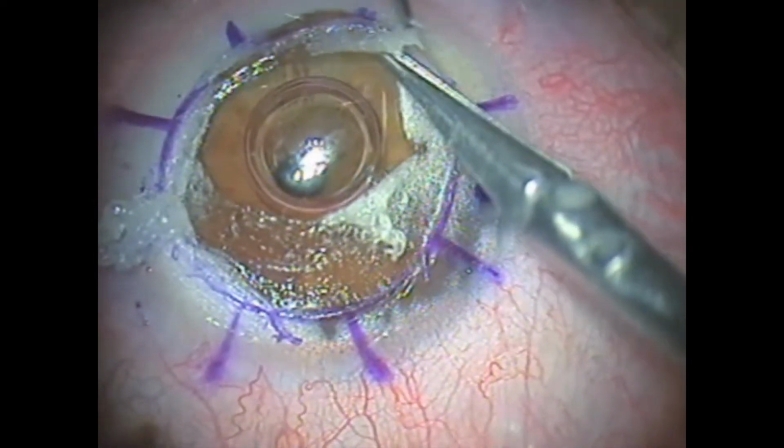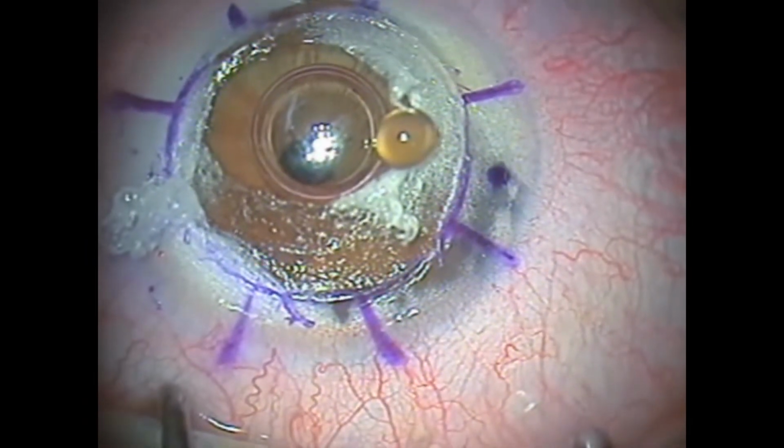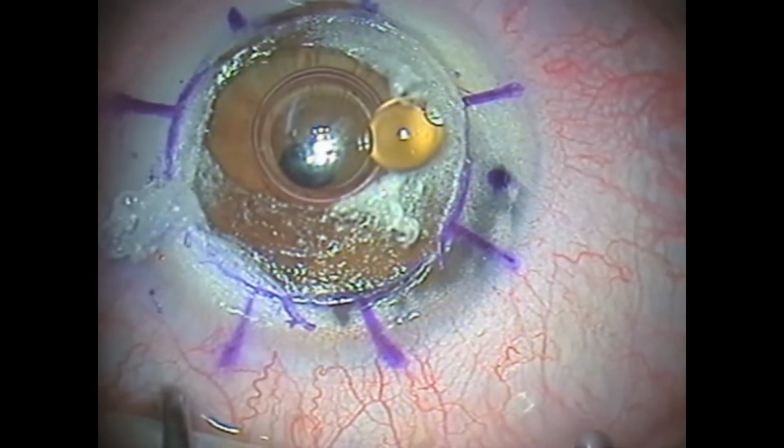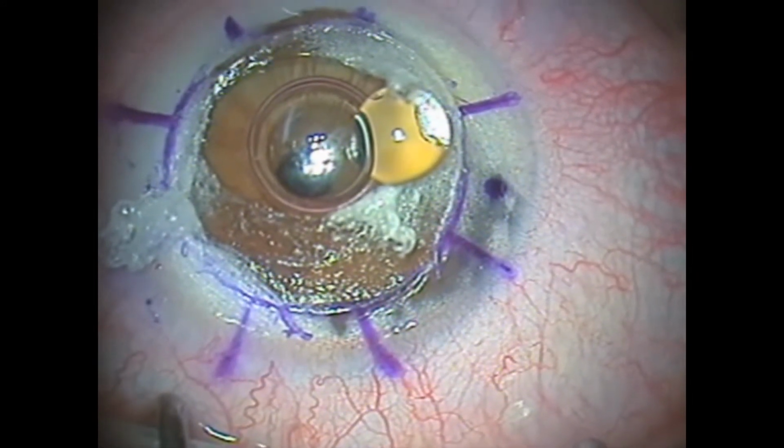This video shows a microperforation during stroma resection. We can see that the perforation didn't happen due to a bad cut, but to the fact that holding the tissue generates a certain force that the eye can't take.